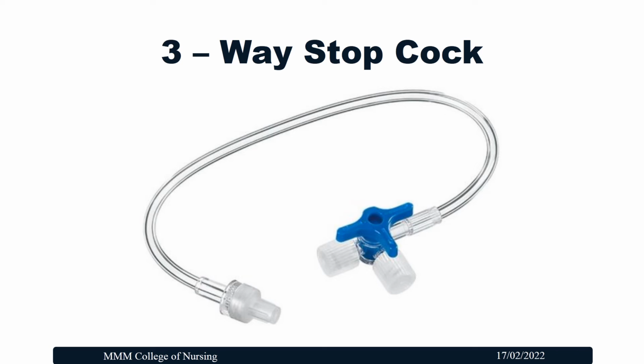The three-way stopcock is also available with extension tubing, which helps to avoid mechanical trauma at the IV site.